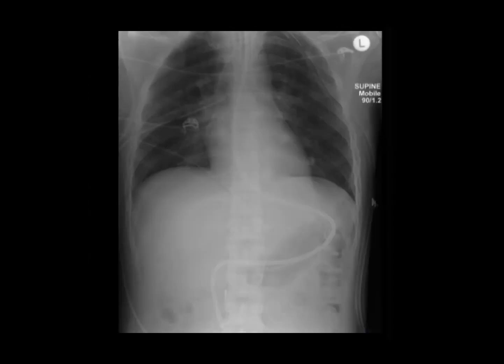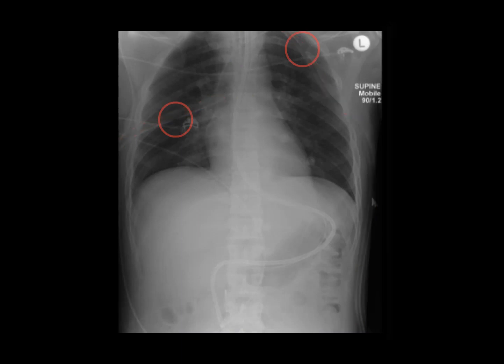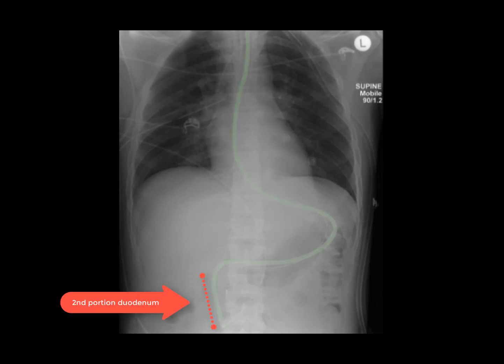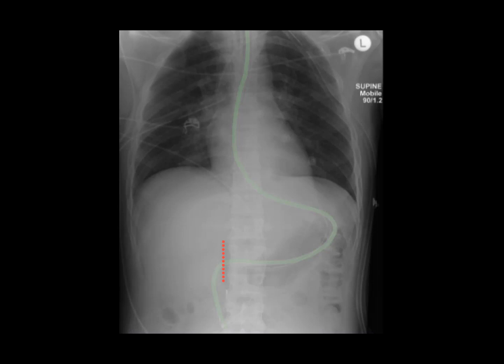We have another quite complicated x-ray, this time focusing on the enteric tube, which means we are clipping the lung apices, starting with the endotracheal tube, which is borderline low with its tip just above the carina. You'll notice that we have two large-bore chest tubes, both with the most proximal side hole well within the thoracic cavity. This patient has a feeding tube in place with tip at the second portion of the duodenum, near the junction with the third portion. This tube is post-pyloric, so it can be used as a feeding tube, but more typically it is present with the tip in the jejunum.